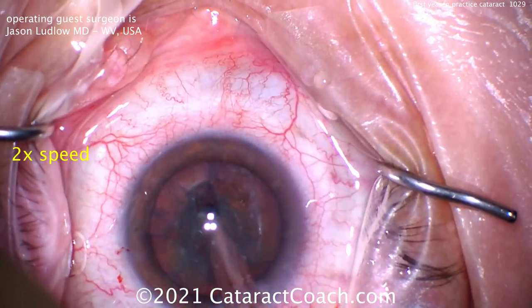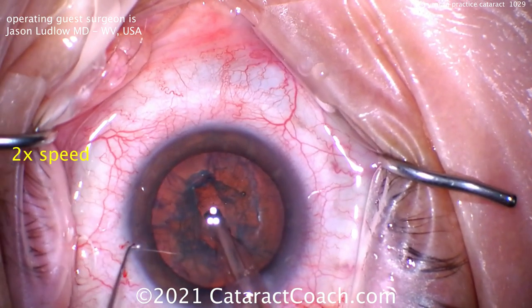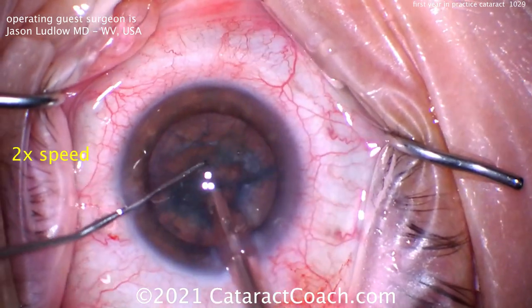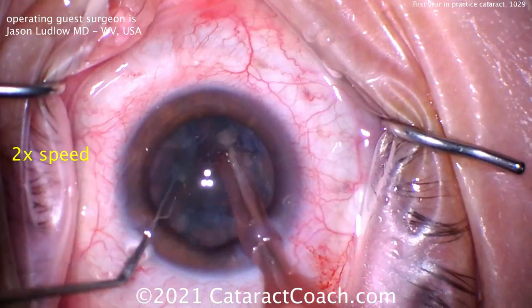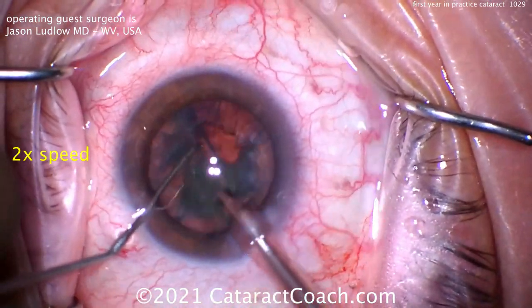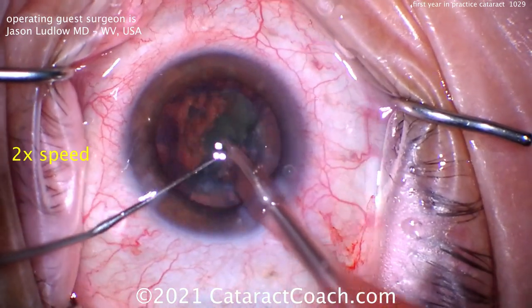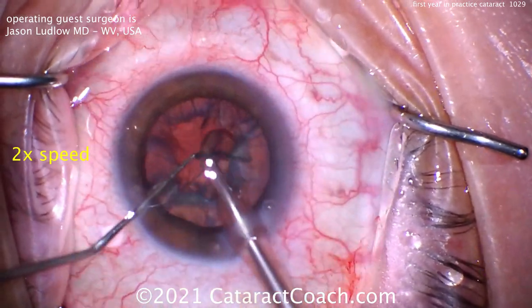Here comes the groove. Notice how the light reflexes stay in the center of the eye — that's great pivoting. And look how few strokes it took: three or four strokes, that's enough. The nucleus is now split. This is very efficient, very minimal use of energy. The chopper is placed around the equator of the lens, chopping it into quarters. Very nice technique. Pushing that first piece down the port, here comes the second quadrant — he's making short work of this. That looks fantastic.